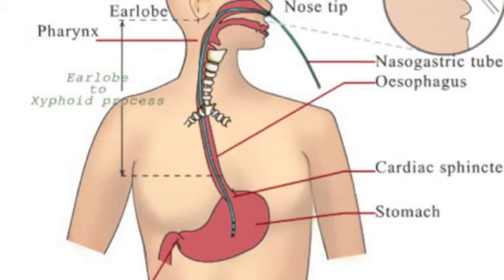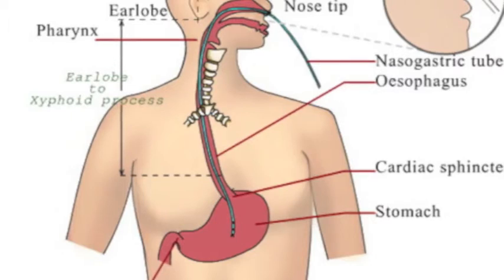How about this size? Insert a 16 French NG tube into left naris. N-A-R-E. No, N-A-R-I-S.